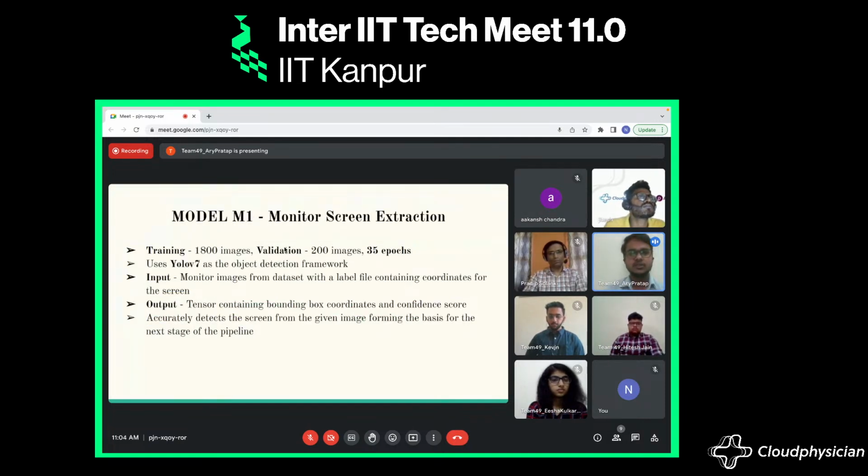So, moving further towards Model 1, which was the first stage. This is the monitor screen extraction model, which, as I've already told, is a single-class YOLOv7 object detection model, and it was trained on 1800 images with a validation set of 200 images and around 35 epochs, because it has only one class to predict. It outputs a tensor which contains the bounding box and confidence score of the predicted monitor screen.